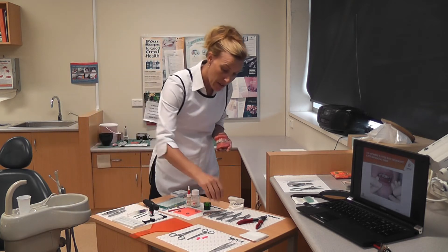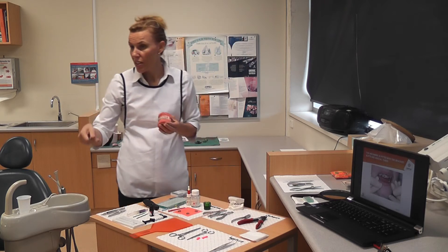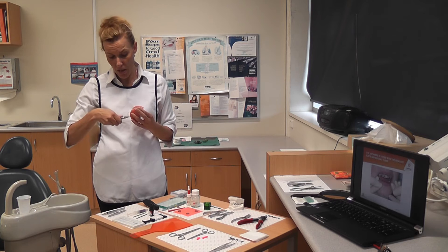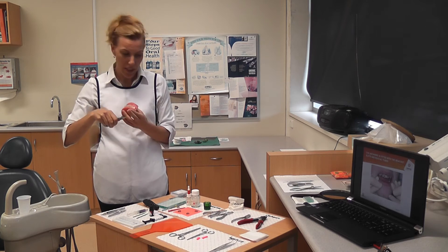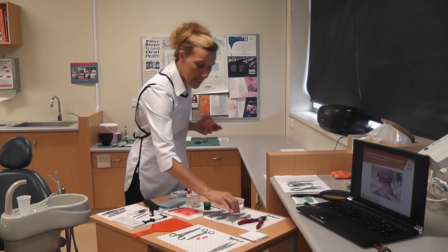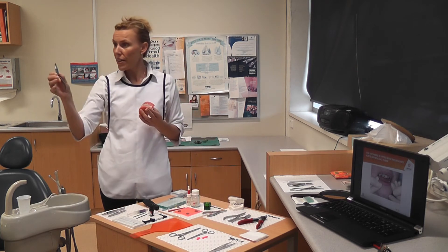To do that, because it's a bit hard getting our fingers on this little tiny wire, they can use an instrument called a Howe to handle the arch wire. It helps with arch wire placement. The Howe has got two big balls on the end.